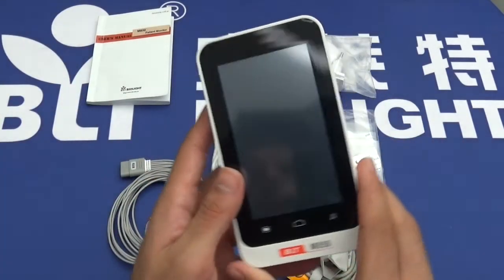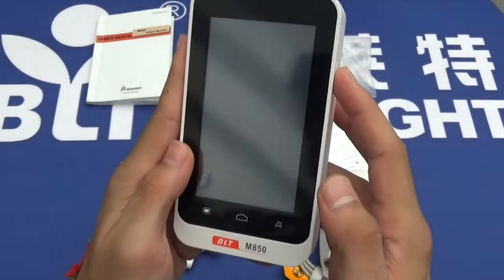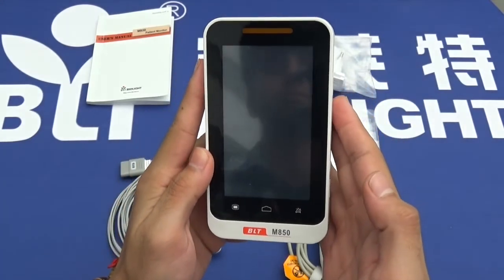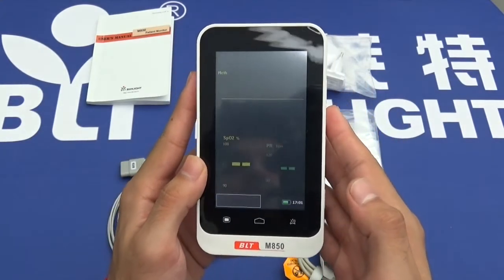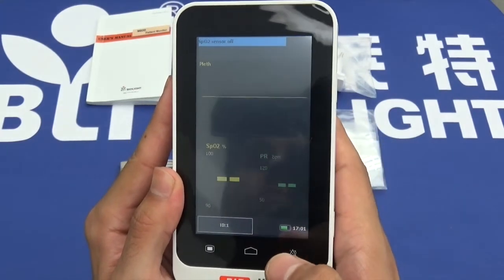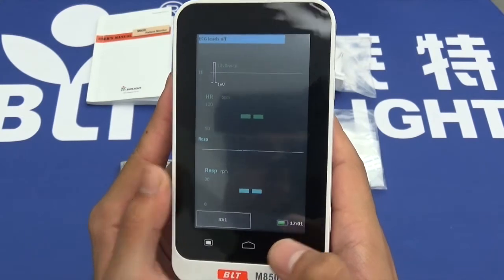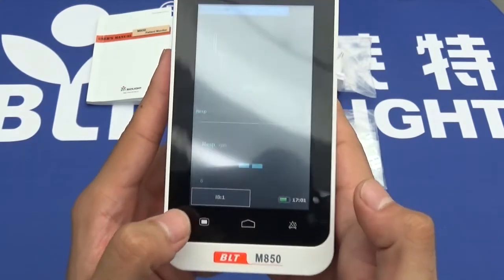To turn the device on, click the on button located on the right-hand side. These screens are all configurable using the middle button — you can change what you want to view. On the left-hand side we have the menu button.